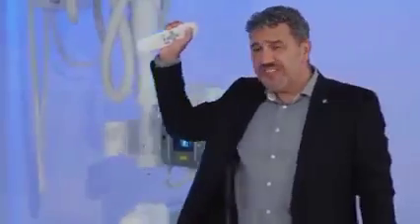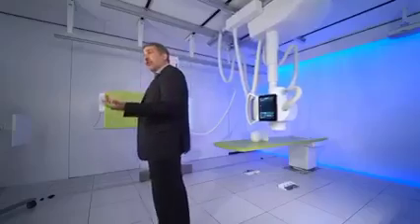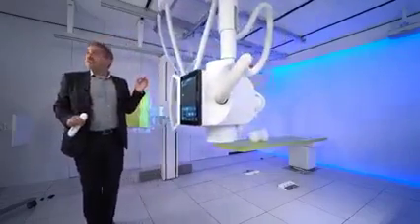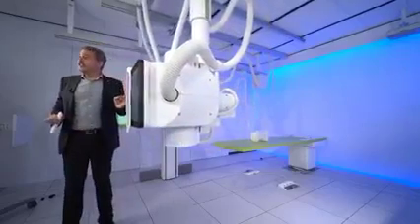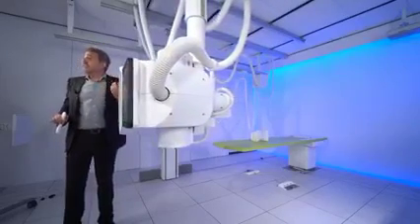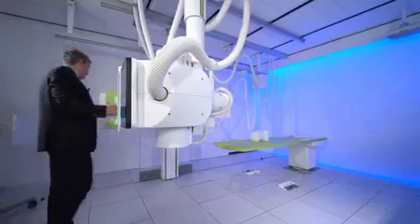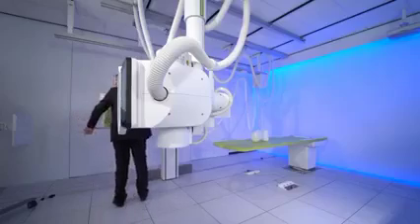Because maybe it's much easier to work in this way if the patients are changing and coming from that side. And now the only thing you need to do, press again those 2 buttons. The system will automatically line up for you. You don't even have to worry how to do this. The system automatically will go to the right position, even with the right angle if needed. But you're ready to perform, for example, now a chest in this way. So multiple ways to set up your own room. Also multiple ways to adapt the system towards your patient.